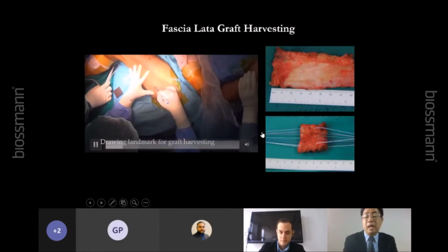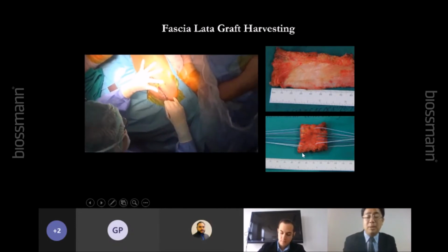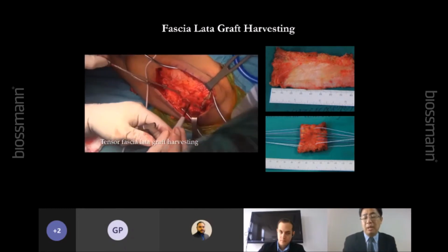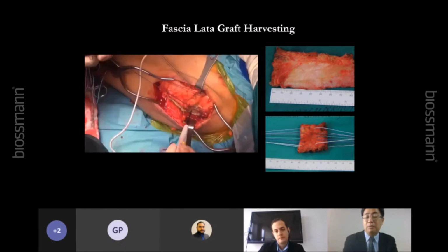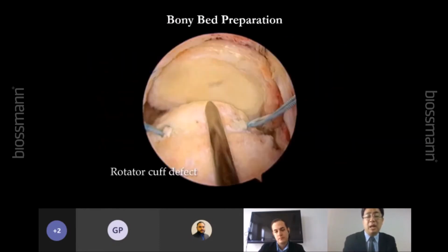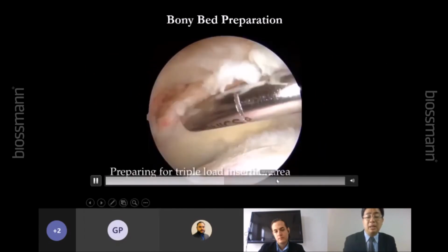So for the SCR, the cuff is quite thick. The tissue graft is quite thick, about 1 centimeter. So if you use a knotless, I think it's not good. So I still use the knot tying for the SCR, superior capsular reconstruction. So this is harvesting the fascia lata and preparing the bed, like that.